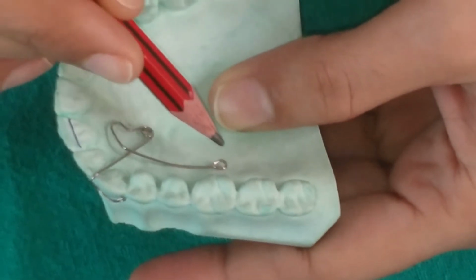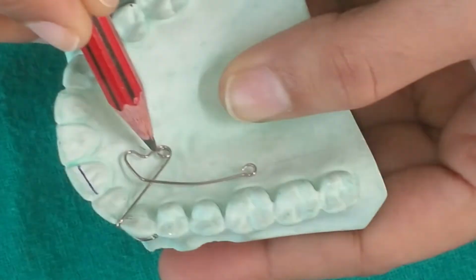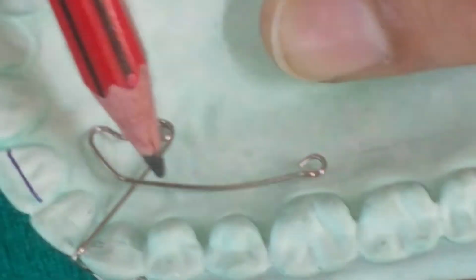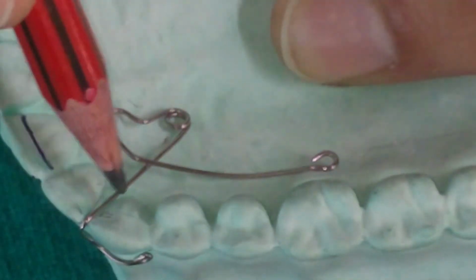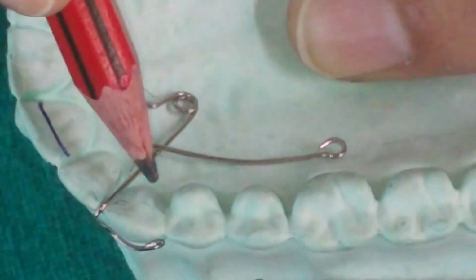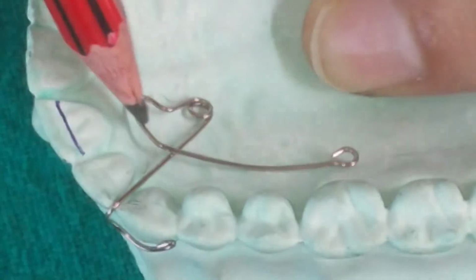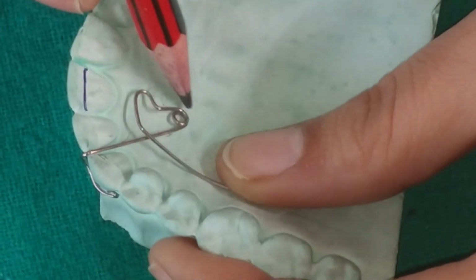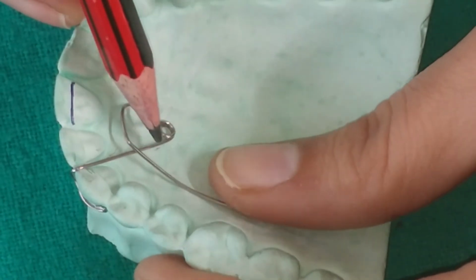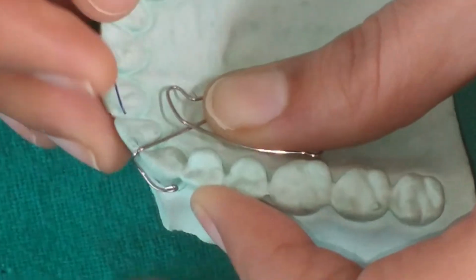This is a well fabricated palatal canine retractor. The arm which is away from the tissue and is outer is the retentive arm. The arm which is close to the tissue is the active arm. The helix is in the axis of the canine, and this is an adaptation loop or adjustment loop. The active arm is towards the tissue and engages the mesial embrasure of the canine.